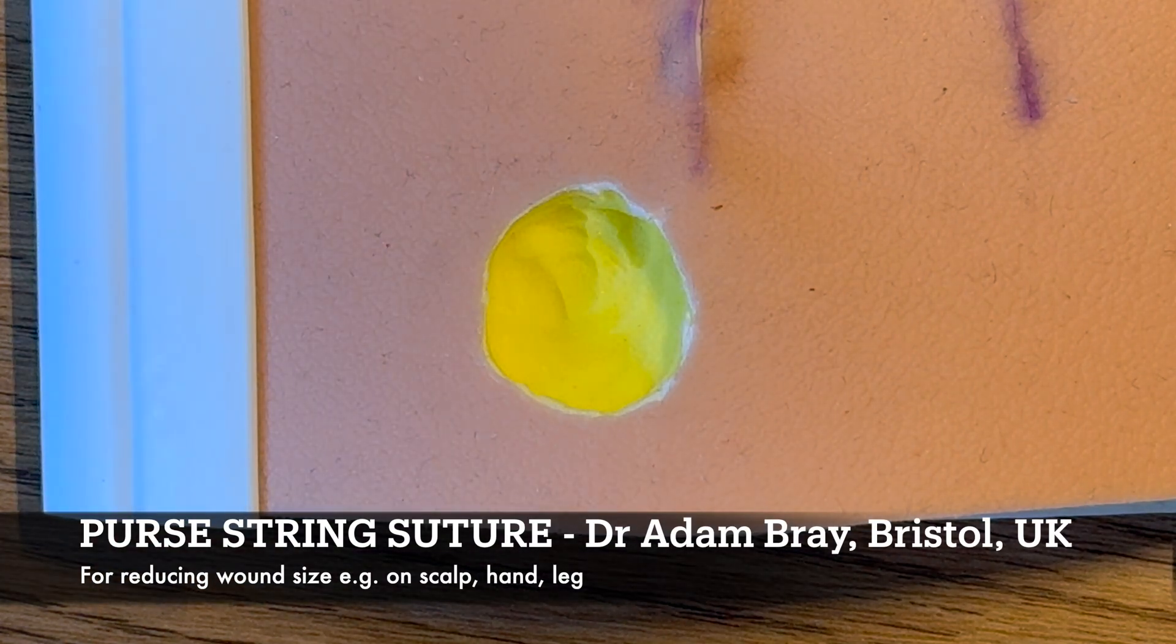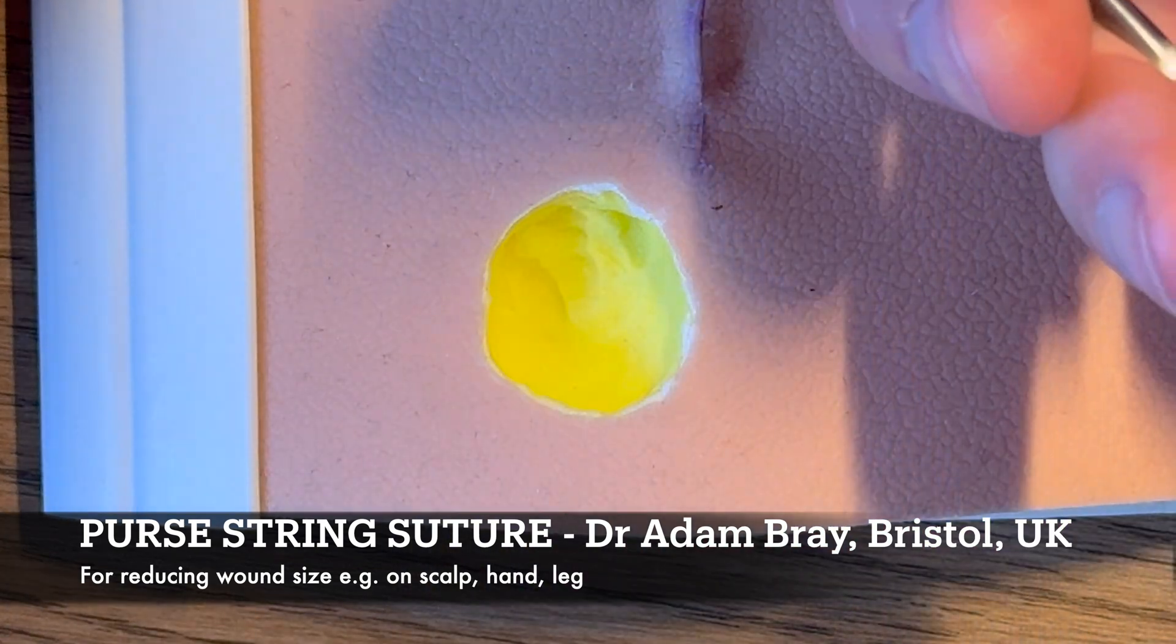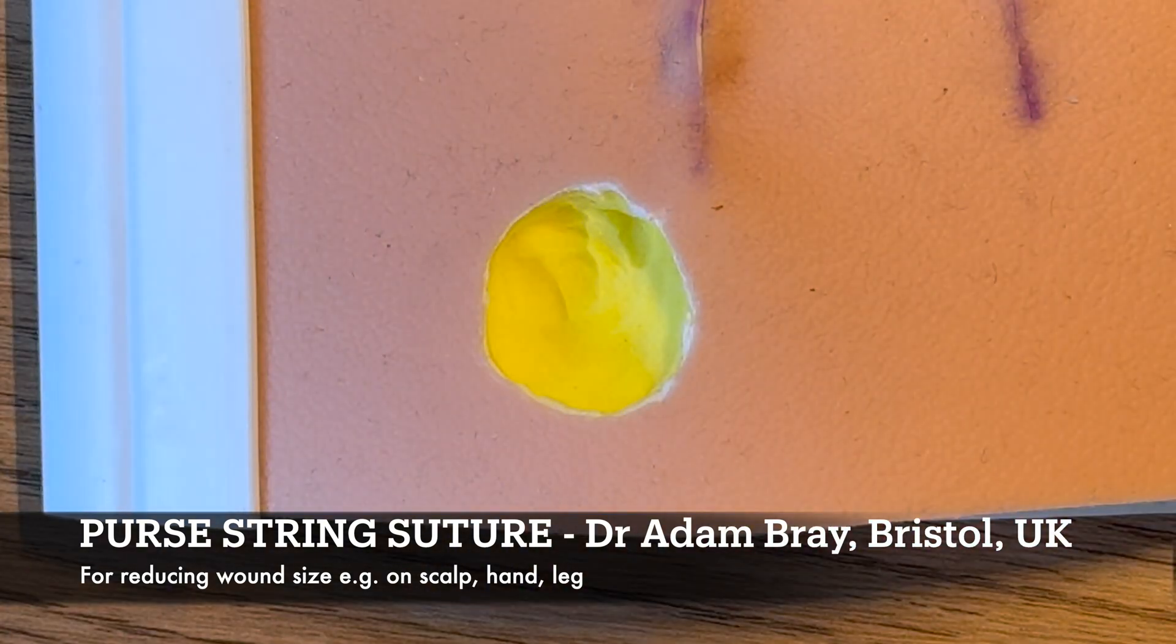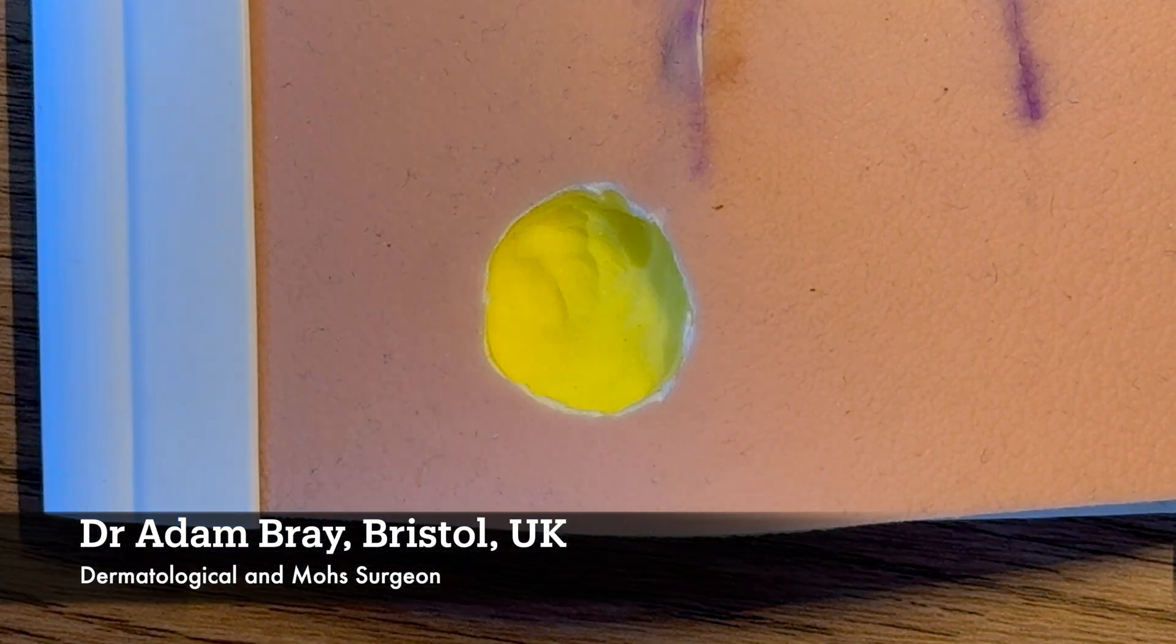Okay, so I was asked to do a video on purse string suture. There's basically two ways of doing the purse string suture: either with a fully buried absorbable stitch or with a non-absorbable stitch through the surface.